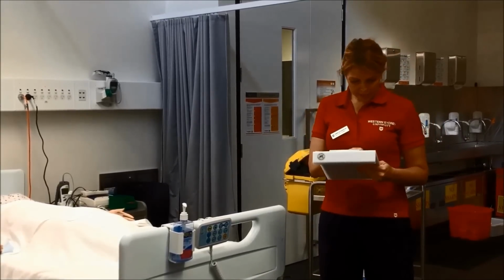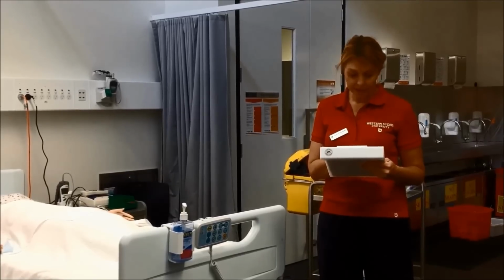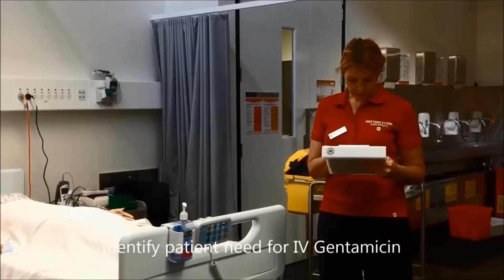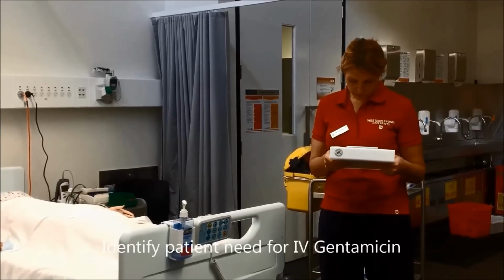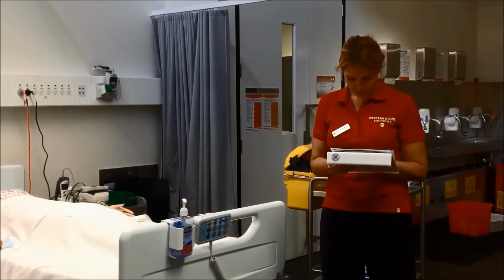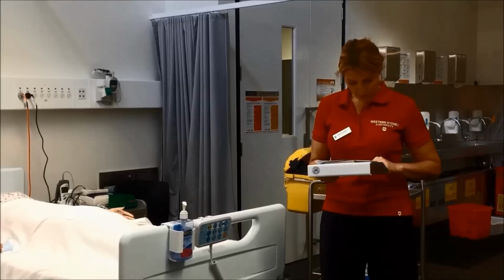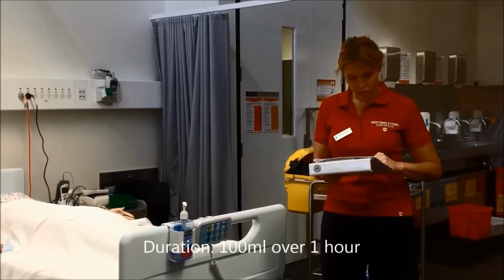Okay, James Lockyer, today's date. He's had an IDC inserted, so we're going to give him a stat dose of gentamicin. So we'll need to give that now. It's been given in 100 mils over 1 hour. Yep. Oh, and he wants the IV fluids commenced as well.